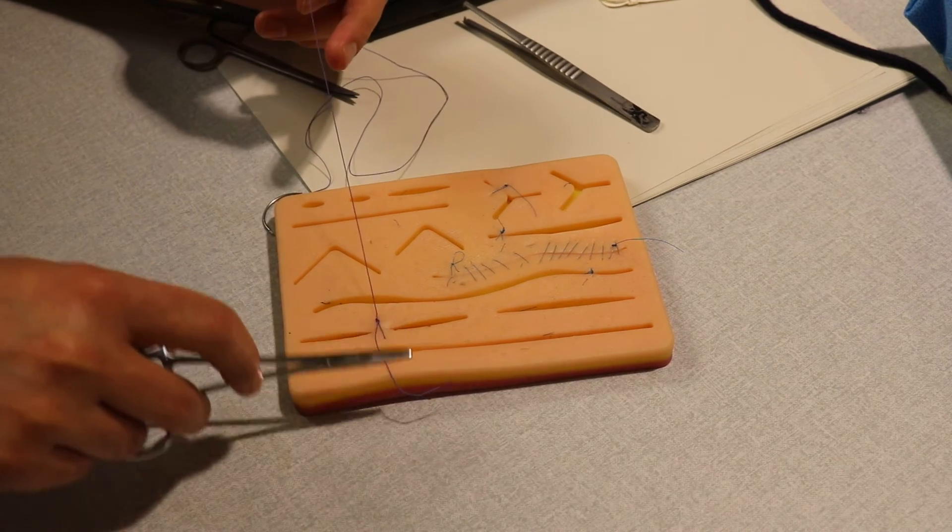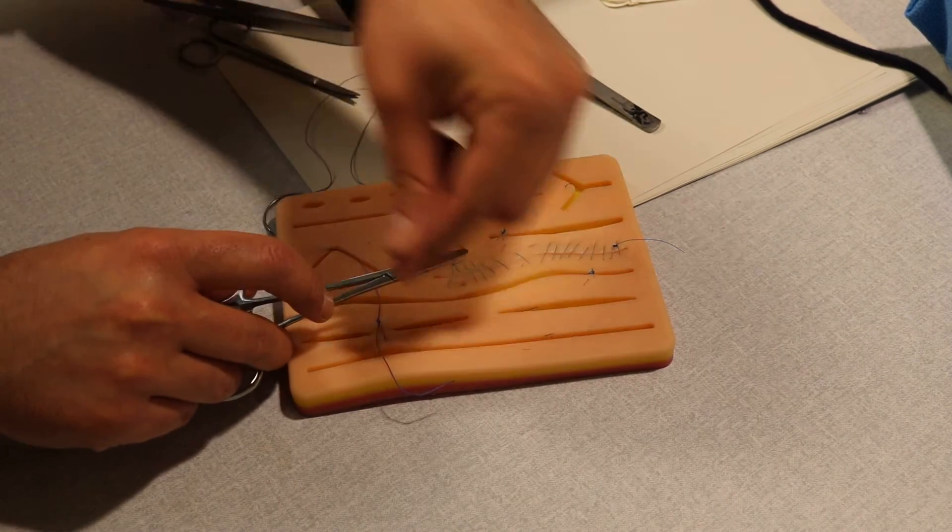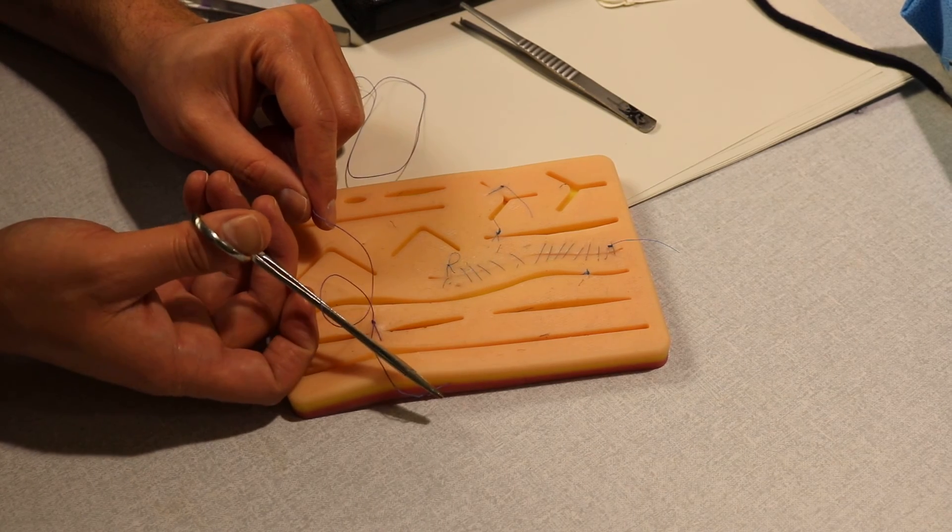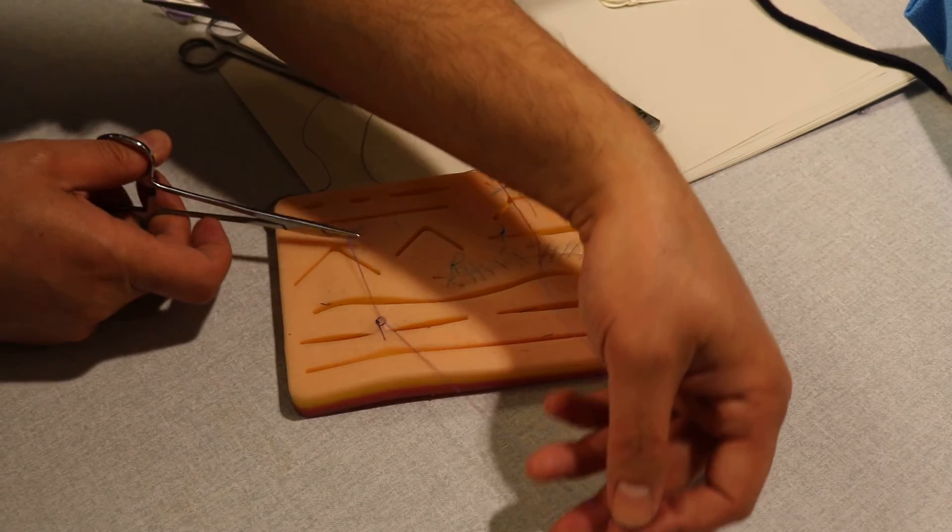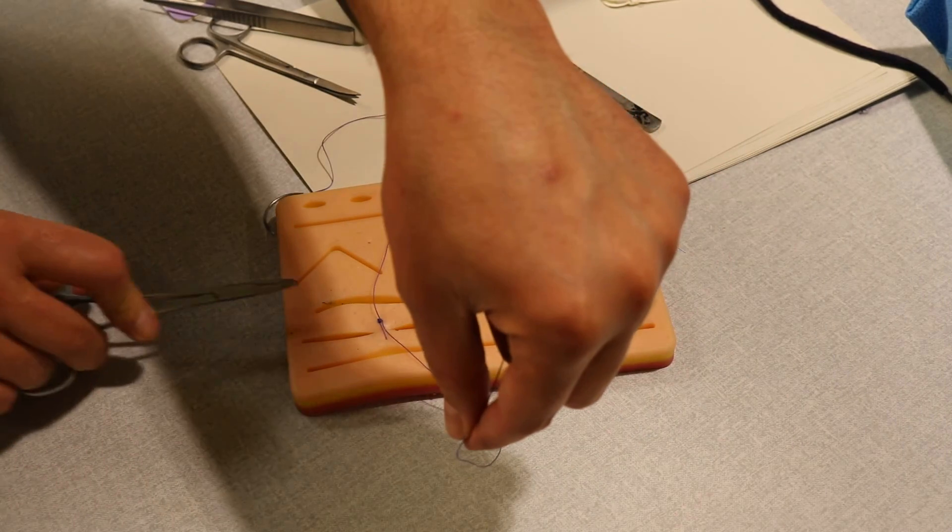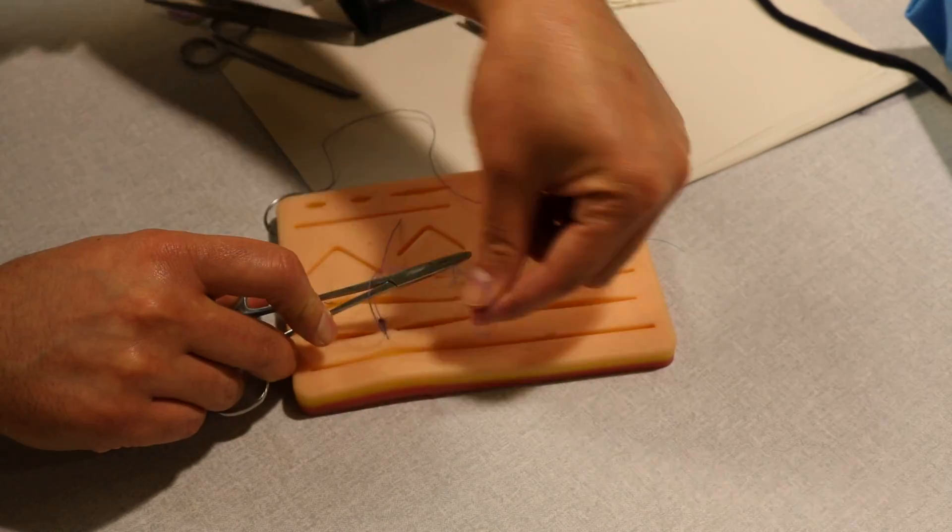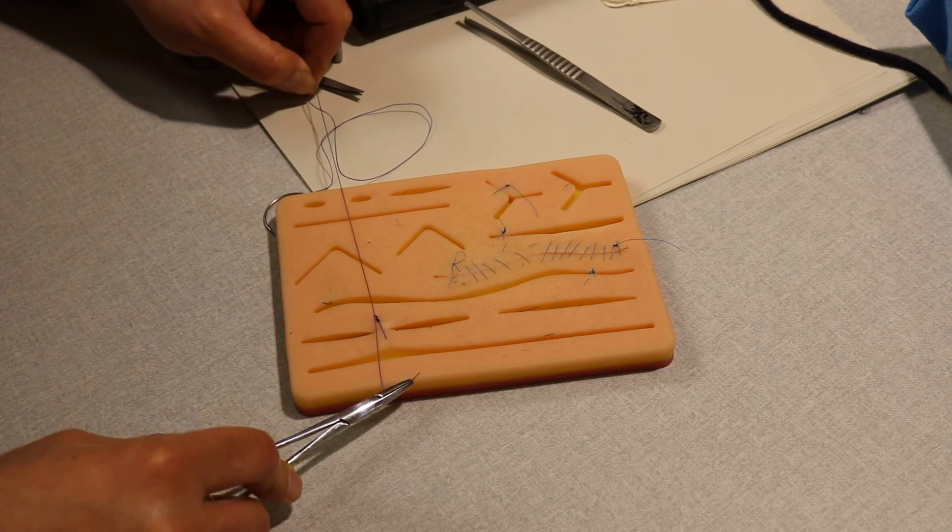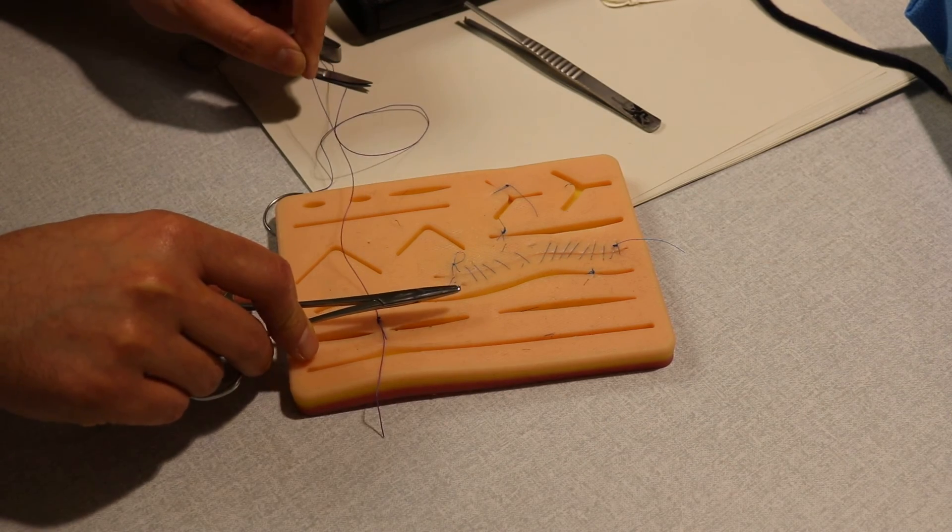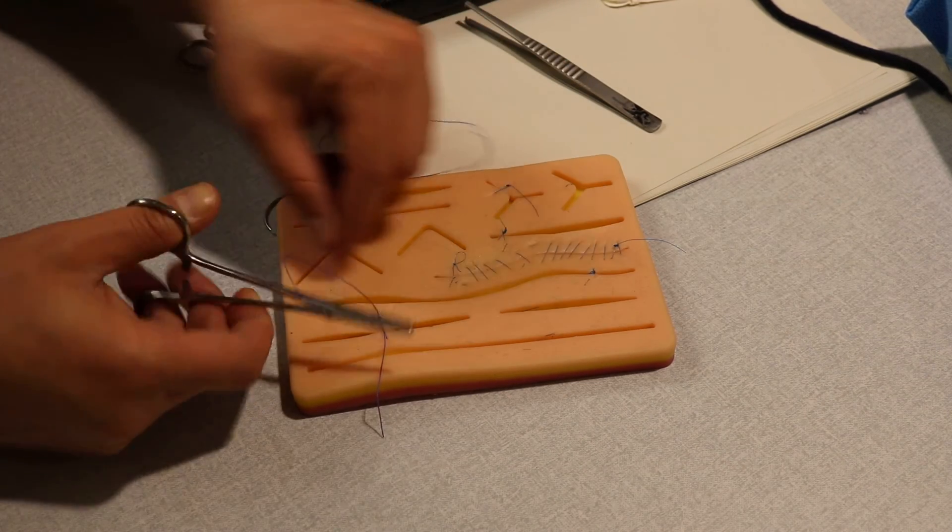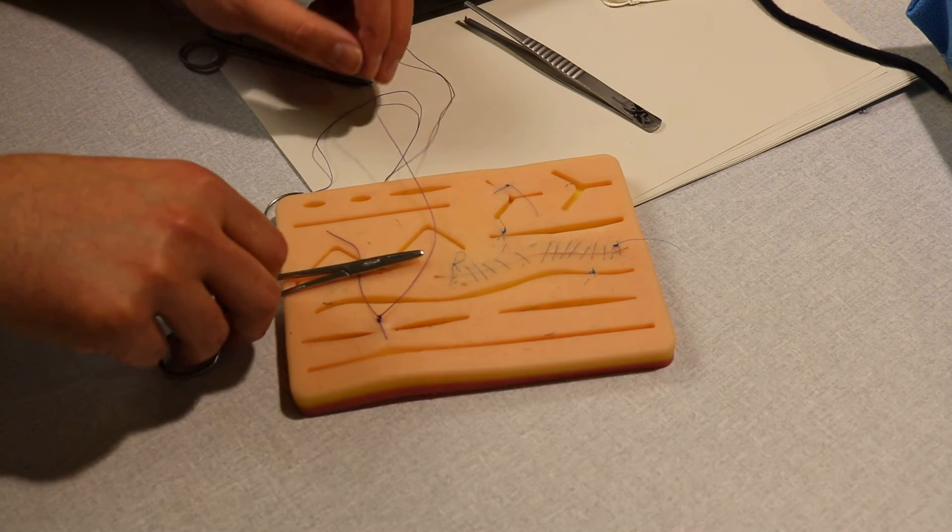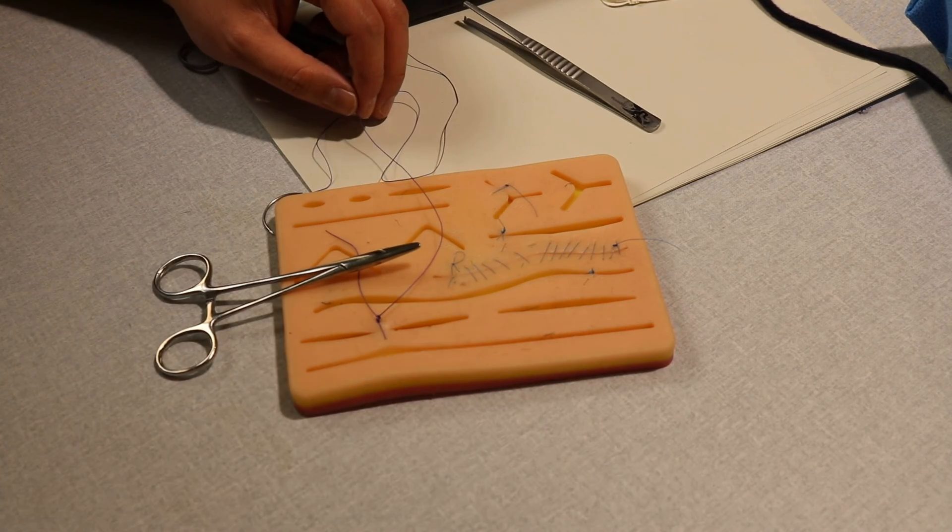That's the first one because I started like this. One loop. I will do it again. I'll go here. That's the second one: loop, pick that up and bring it to the other one through the loop. Let's practice it. I will do it again with the tricks and tips.